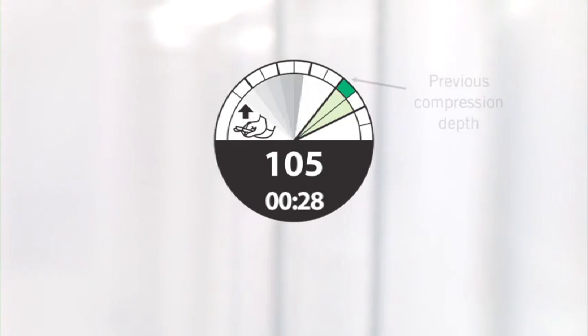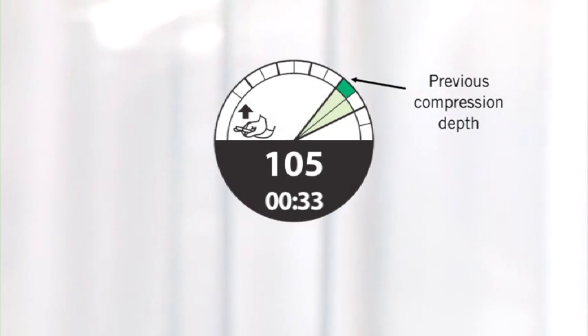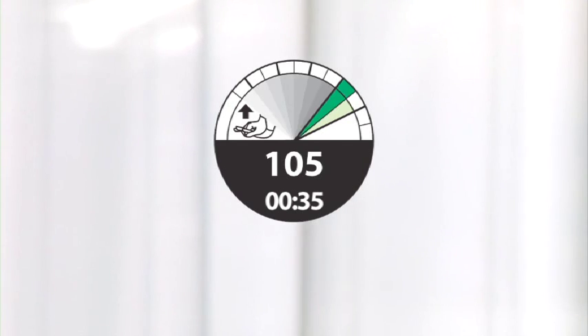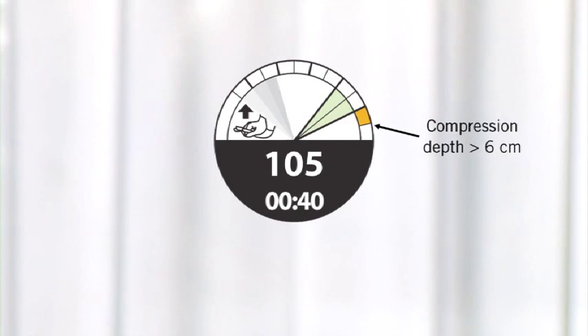On the outer circle of the dial, a marker shows the depth of the previous compression to indicate how you should adjust the next compression. If compressions are too deep, an orange wedge appears beyond the target zone.